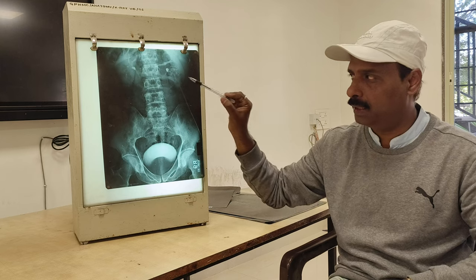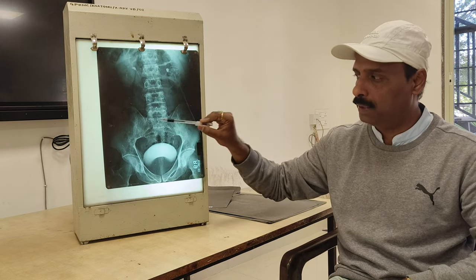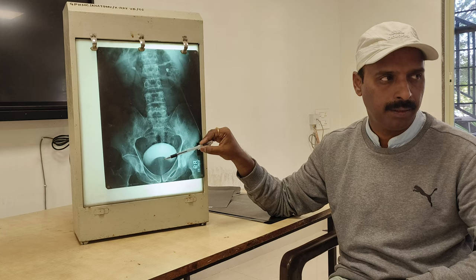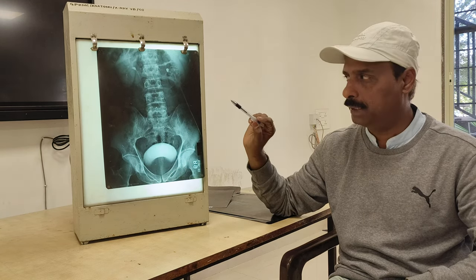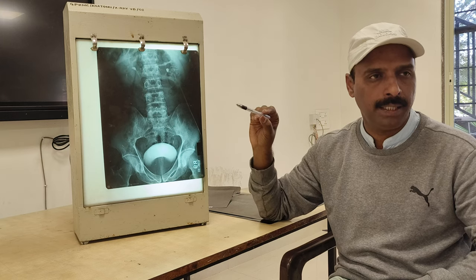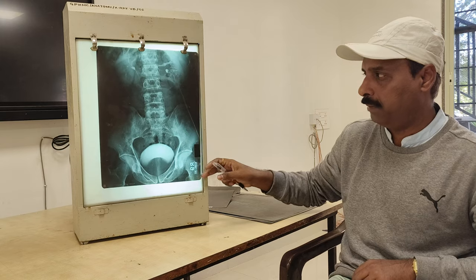The kidney stones are seen with the ureter and the vertebral column. This is the hip bone, and this is the pelvic brim or pelvis, which contains the urinary bladder. So this is the urinary bladder region, with the pubic symphysis here. In the identification of this X-ray, you have to say it is an X-ray of intravenous pyelography. It is also a contrast type of X-ray.